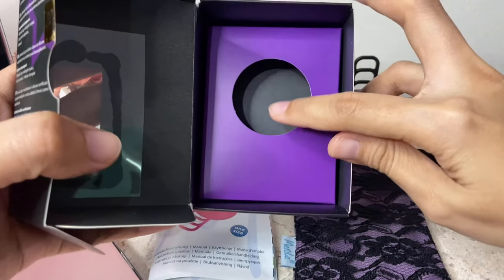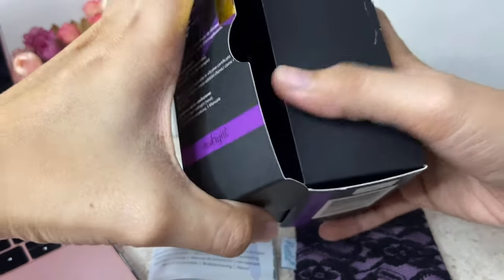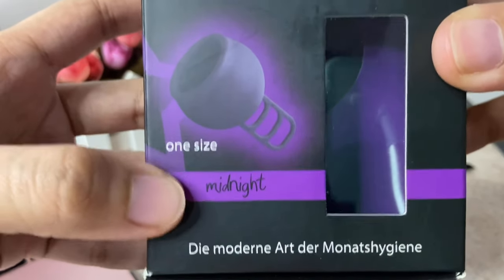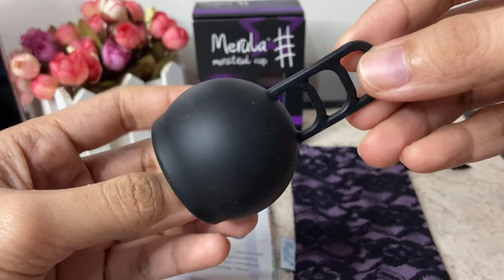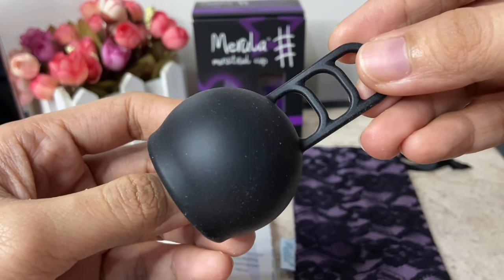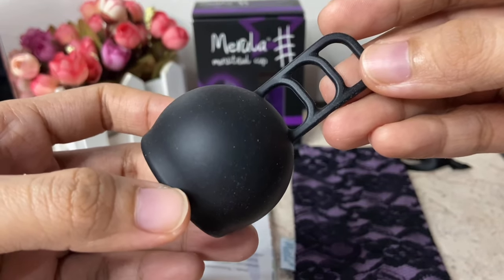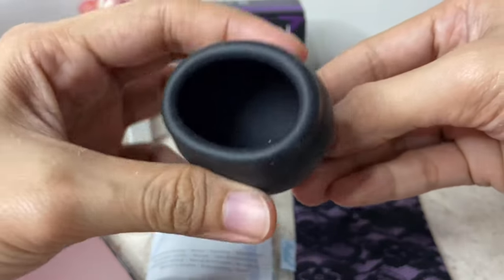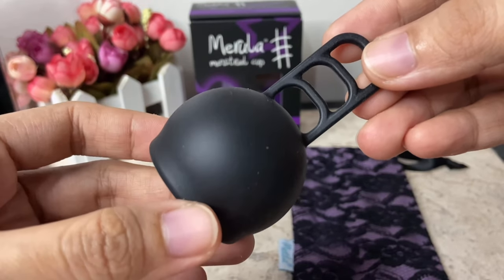Inside the box, the cup is on top, and underneath is the user instruction and the breathable pouch that is coordinated to the color of the cup. This one is in midnight — that's their color black. As you can see, the silicone material of the Merula cup attracts dust, so it is very important to wash and sterilize before use. This is made of high medical grade silicone and the Merula cup is FDA registered, so it's safe to use. The quality of the cup — it is soft and pliable, but the silicone material is firm.